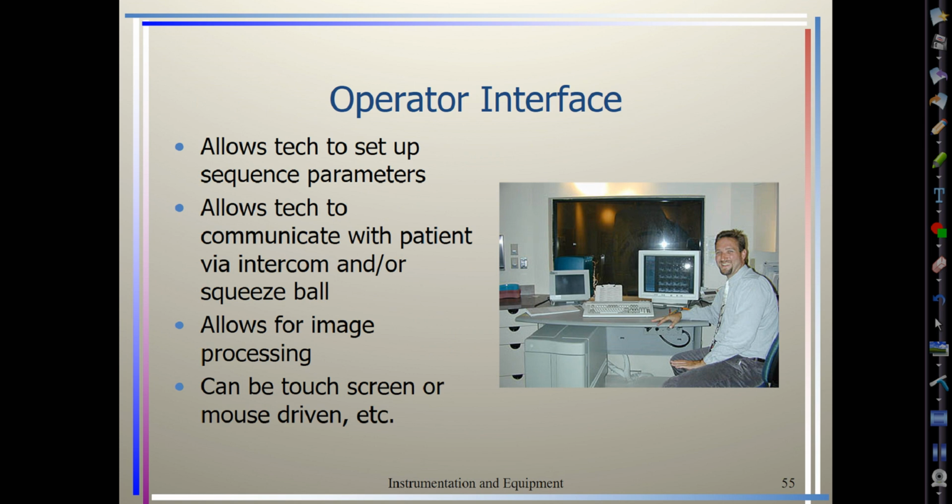Our operator interface, this is where we as technologists are selecting the protocols, manipulating the parameters, communicating with our patients via the intercom and the squeeze ball, and turning on music for them. You can change if they have light in the scanner, if they need a fan. Some scanners even have different languages for breathing commands. And it could be touchscreen or mouse driven.